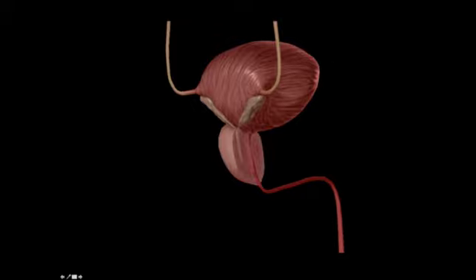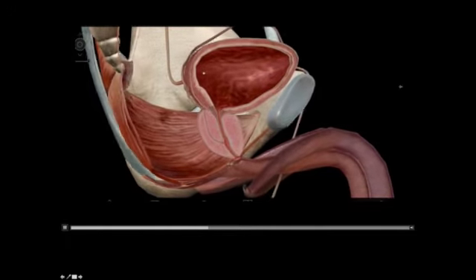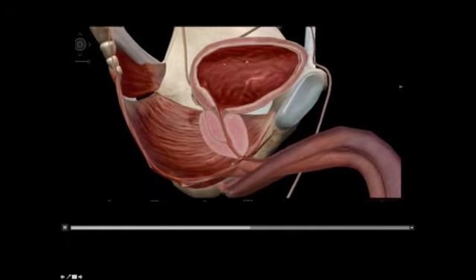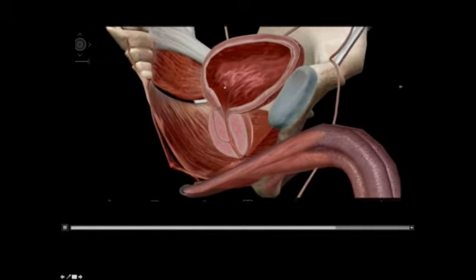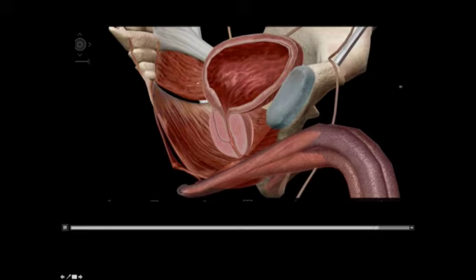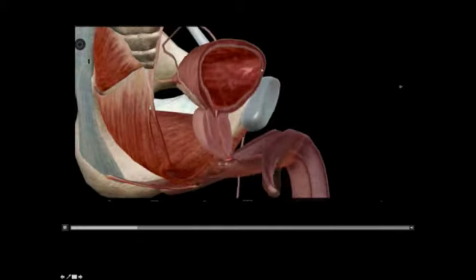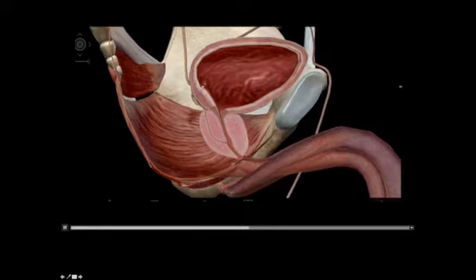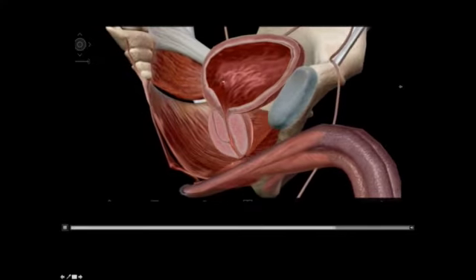So we're going to look from the front, and we're going to put the probe on here and look back here. And so we can look in longitudinal and we can see the entire thing this way, or we can look transversely, and you're going to see this little ureteric outlet there as your probe cuts across. And so you're going to fan up and down, and this is really what you look at. You're trying to look to see where that ureter comes in. You can see the last few centimeters of the ureter, particularly if it's distended as it comes across and into the bladder wall.